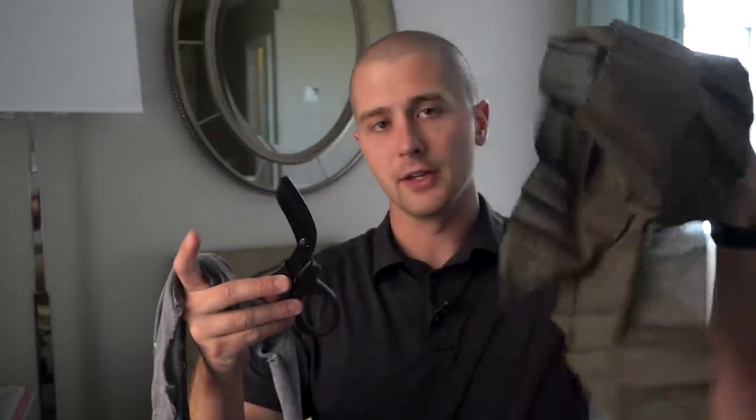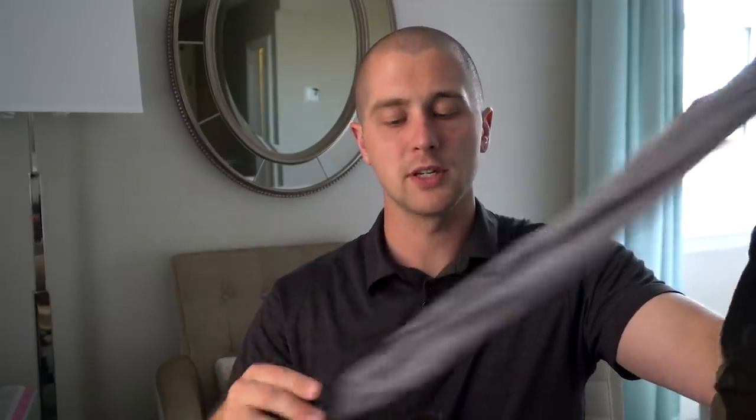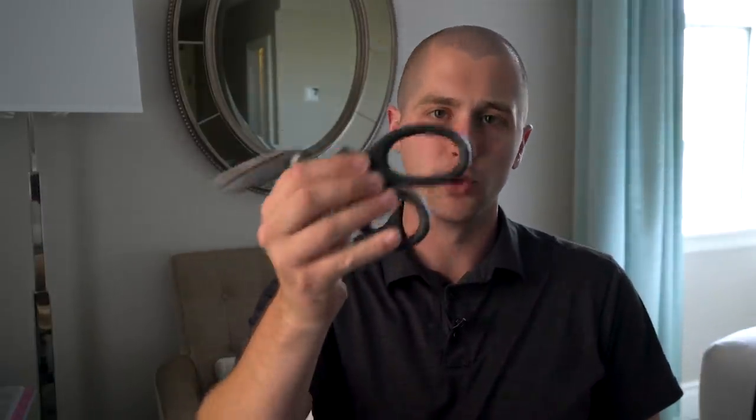So let's start with tourniquets. To make a makeshift tourniquet you just need three things. Right here I have a cravat, which is a triangular bandage — it doesn't have to be this, it can be any kind of fabric — and you're gonna need two strips. This is just a cut-up t-shirt that I'm gonna be using. Then you need something to act as a windlass. I'm gonna be using my x-shears for this, but this can be anything — a stick, a piece of silverware — it just needs to be something that can have a lot of force exerted on it and not break.